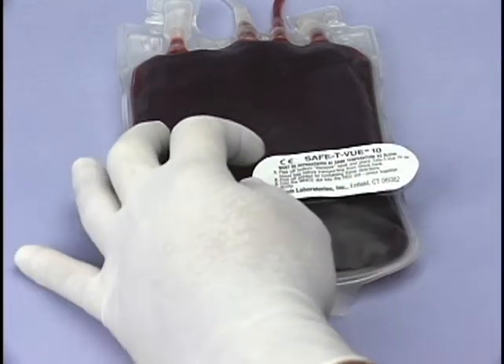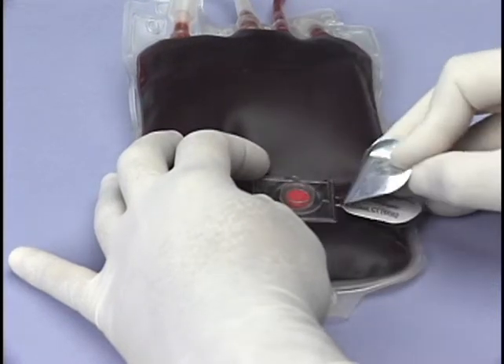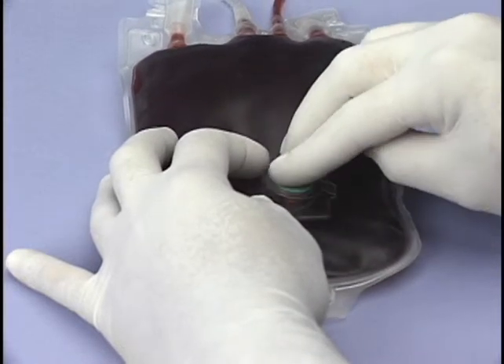Hold the Safety View indicator against the bag with your fingertips and peel off the top printed paper lid to expose the red and white rounds. Fold the white round into the red round and press together.